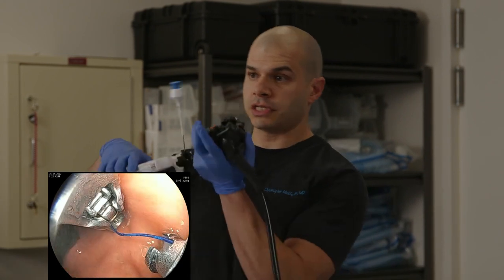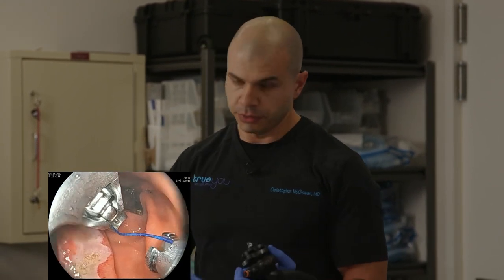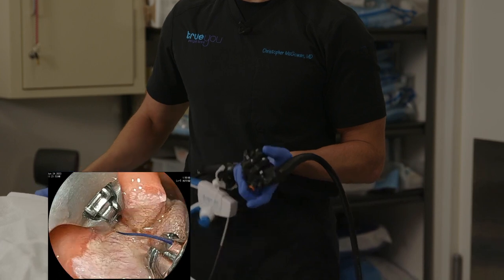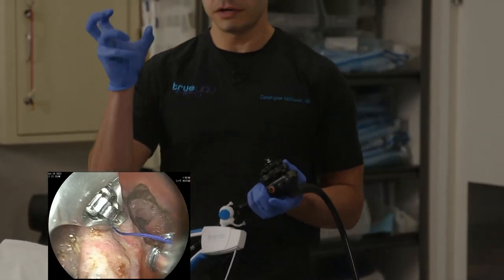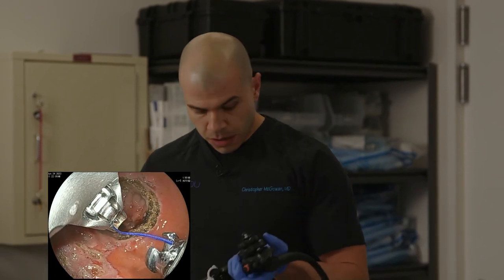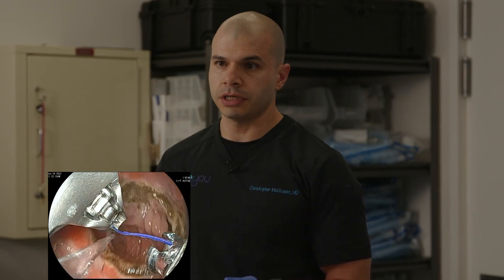So I'm controlling this externally with a handle, which will drive our needle internally. And you can see the blue suture material, which is a polypropylene, Prolene suture material. This is not dissolvable. The suture will remain in place. But what's really neat with this procedure is once everything heals nice and snug and tight, the suture is basically irrelevant because this will heal, and we'll show you some examples later on. So you can see this is our treated anastomosis.